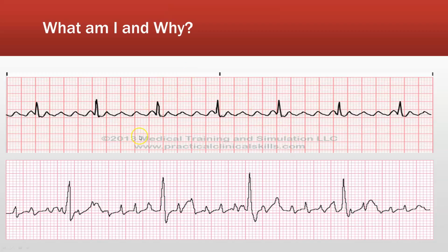Okay, these two rhythms are exactly the same. And again, this is why I put them on here, because I wanted to outline, oh my gosh, those are pretty F waves up top, right? I see a 4-to-1 block. Down here, I see more of a 1, 2, 3, 4, 5, 6-to-1 block, but it doesn't really do anything because I can see that my R to Rs, for the most part, are fairly consistent. I think it's more consistent between the second and last little segment here.